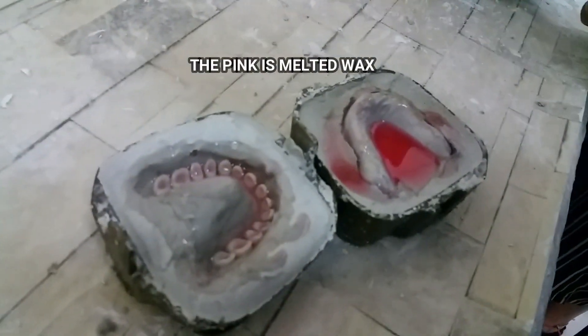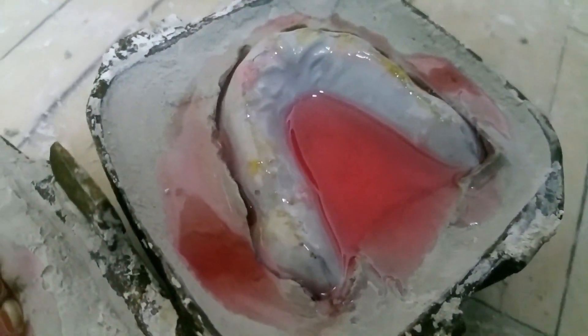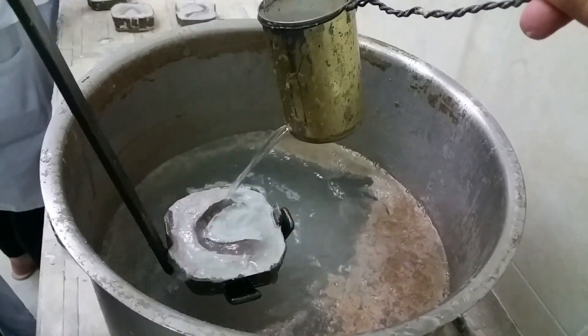After five to ten minutes, when the wax has melted inside the flask, we remove the flask from the boiling water and open it up. It will be filled with melted wax, which now needs to be removed. We did this by flushing it out with boiling water using a tool, and once all the wax and base plate material has been removed, we can start the acrylic step.